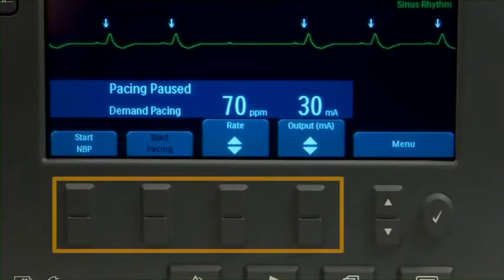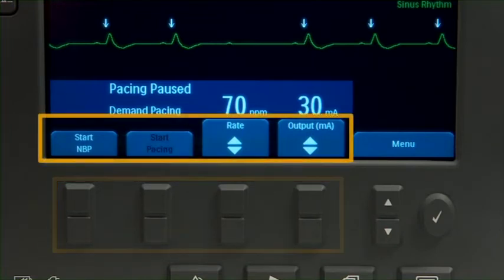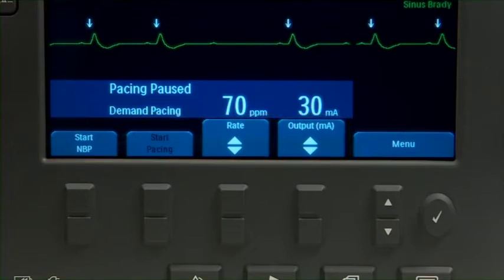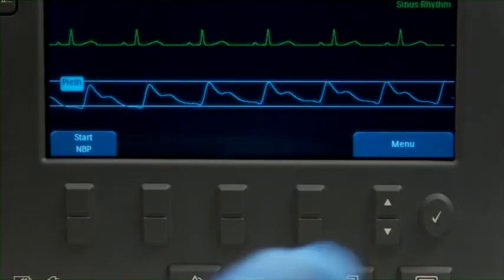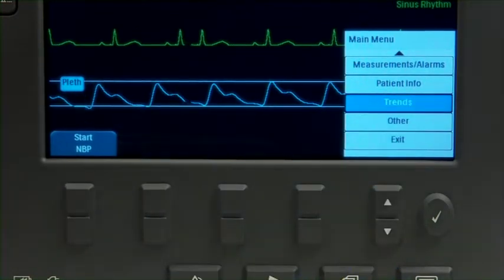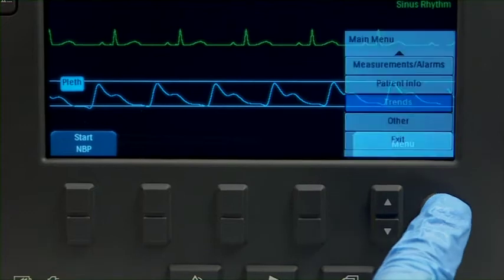Below the display, there are four soft key buttons that perform the function listed on the soft key label immediately above. The button labels change according to the function you are performing. Press the Menu Select button and a menu appears to provide access to additional functions. Press the up or down navigation buttons to scroll through the available choices until the desired selection is highlighted, then press Menu Select again to confirm.